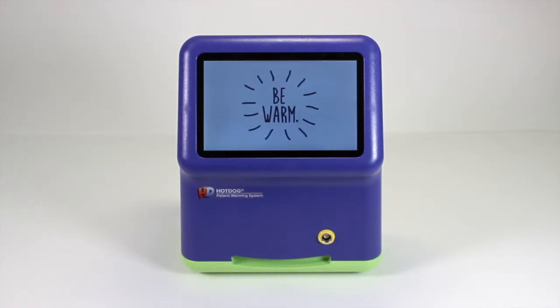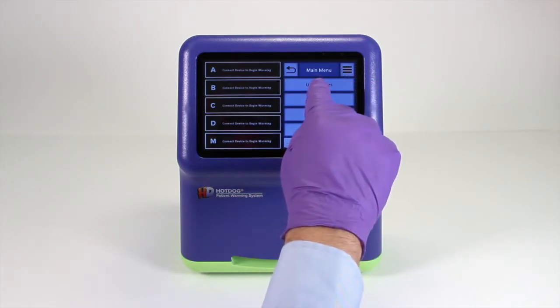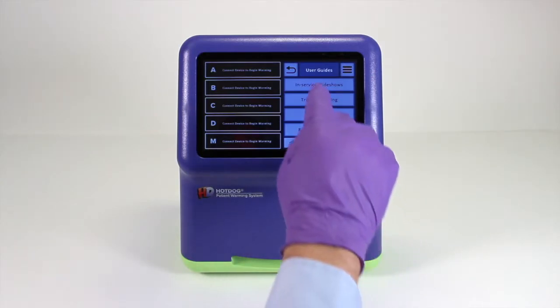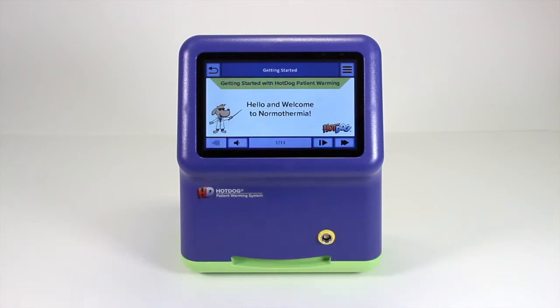A key feature of these new controllers is the touch screen, which allows more information to be conveyed to the user and improves the user experience. Under user guides, there are four slideshows with helpful information about getting started, an overview of the technology, obtaining the best results, and hypothermia 101.